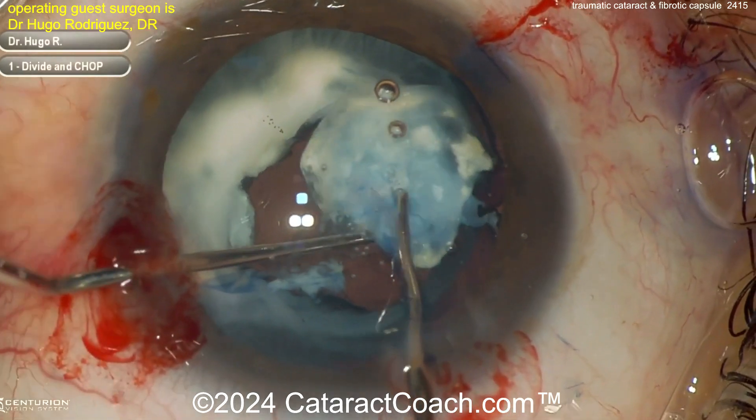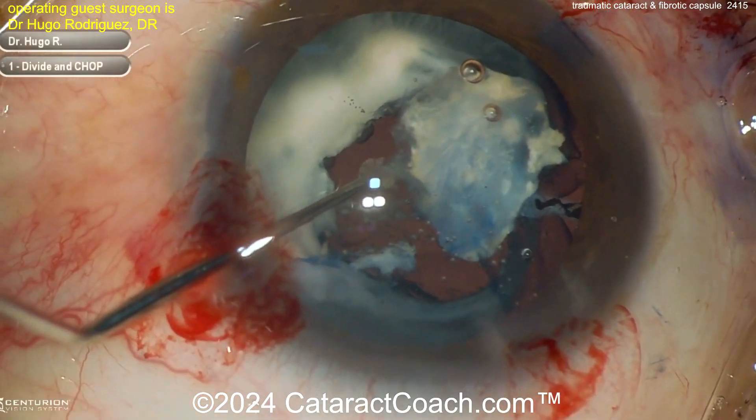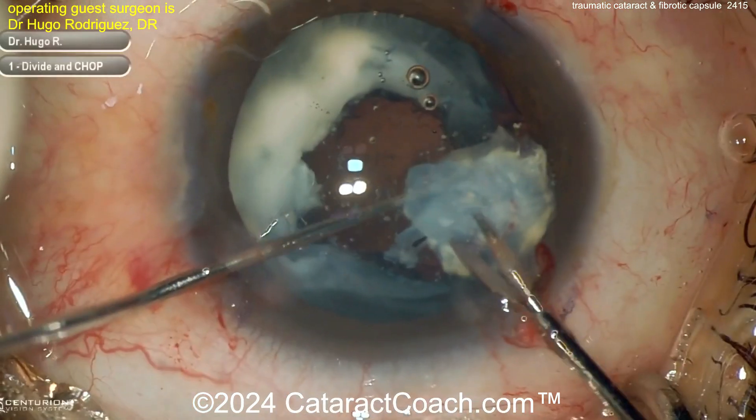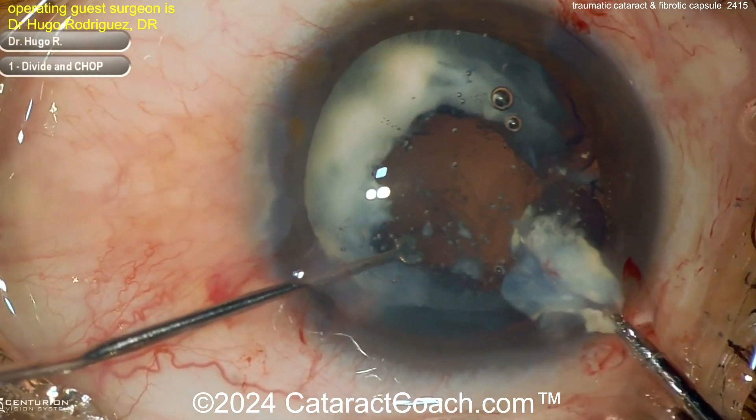This patient probably had a lot of inflammation in the eye for a long period of time. While the capsule bag appears mostly empty, it's because most of this lens material has been liquefied and then absorbed.